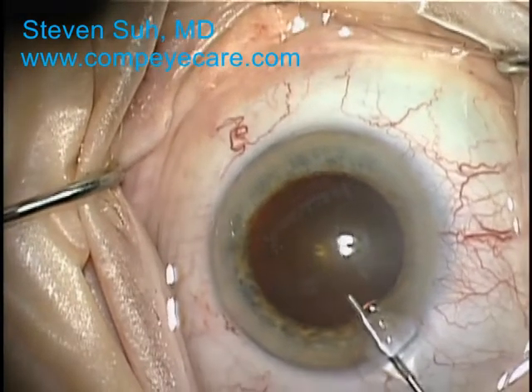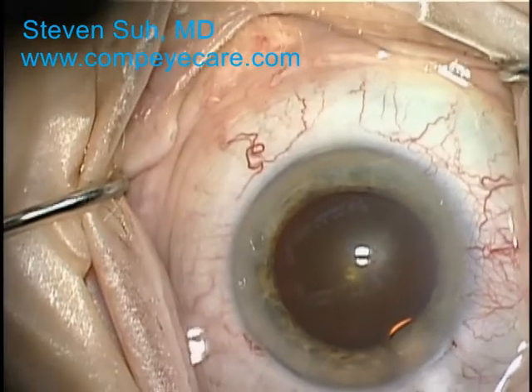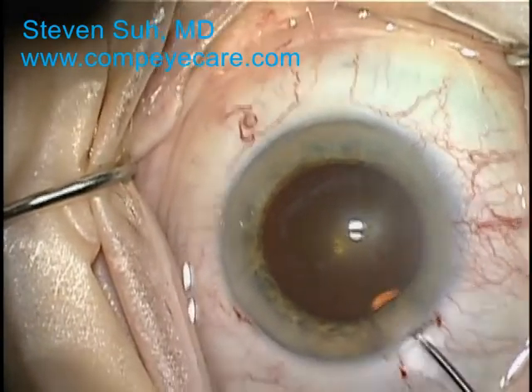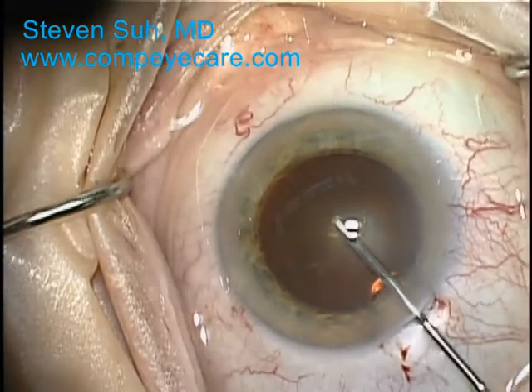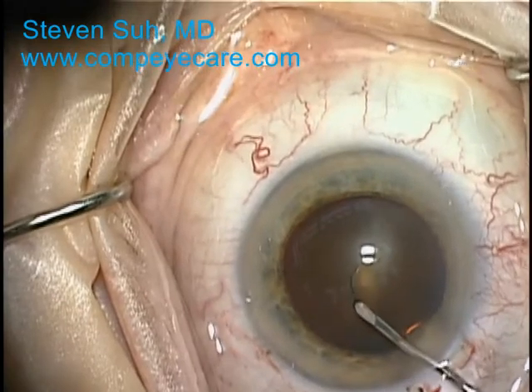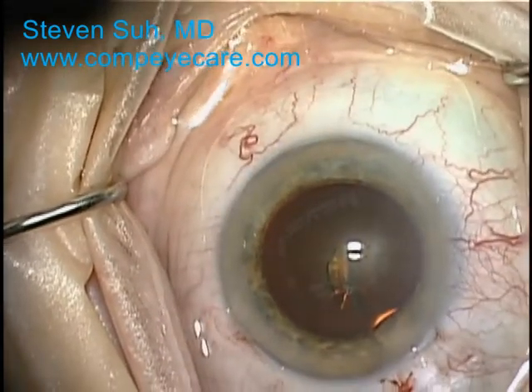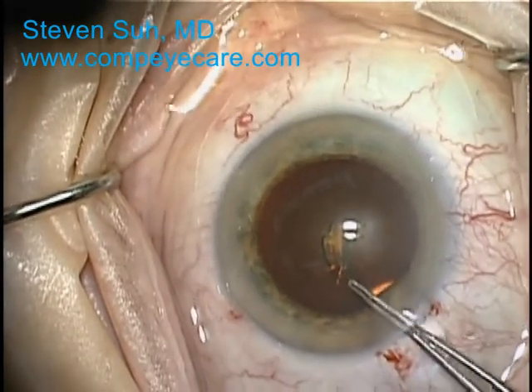I inject more viscoelastic into the eye so that it does not collapse as I insert and remove instruments from the eye. This is the cystotome, which is a bent needle used to puncture and initiate a tear in the capsule of the lens. I complete this opening with Utrata forceps.